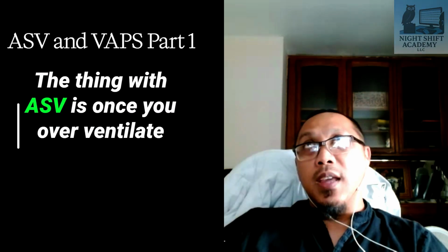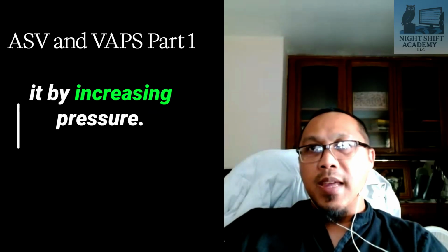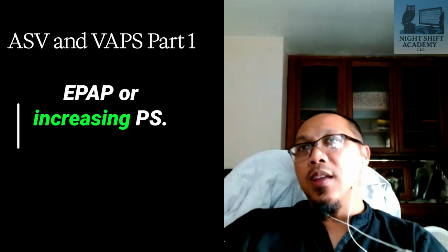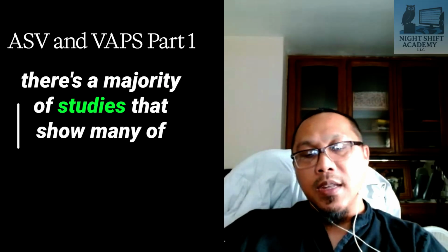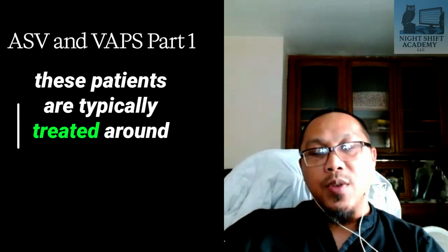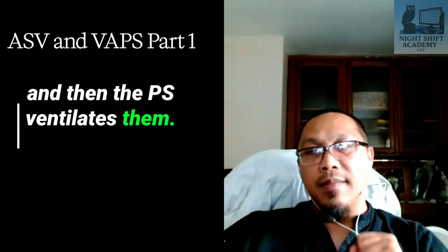The thing with ASV is once you overventilate the patient, you cannot fix it by increasing pressure, whether you keep increasing EPAP or increasing pressure support. And most of the time, a majority of studies show that many of the patients are typically treated around an EPAP of 8 to 12. You don't raise them up, and then the pressure support ventilates them.